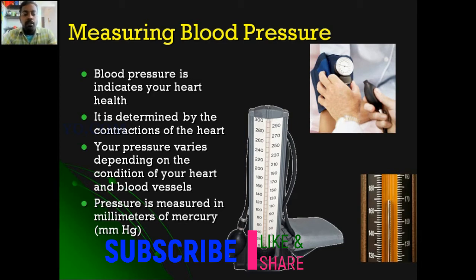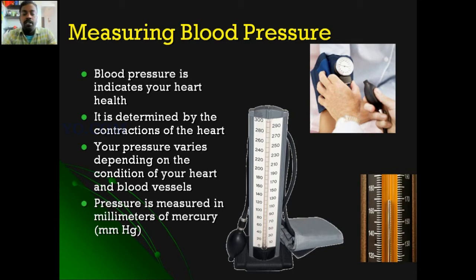Then, pressure is measured in millimeters of mercury, that means mmHg. The blood pressure is measured in mmHg.